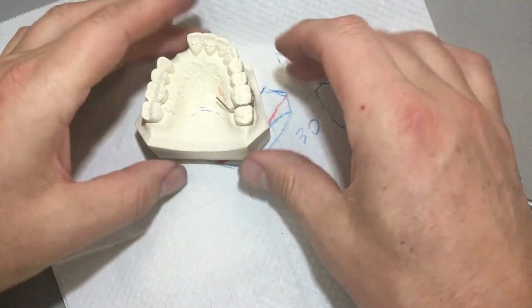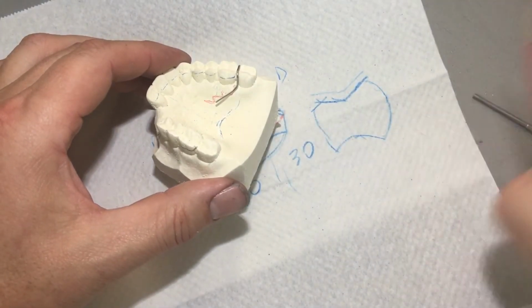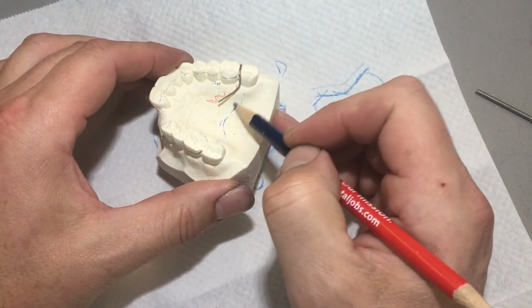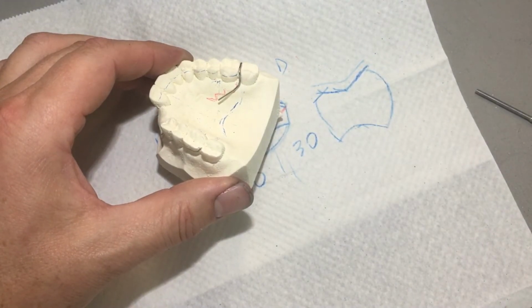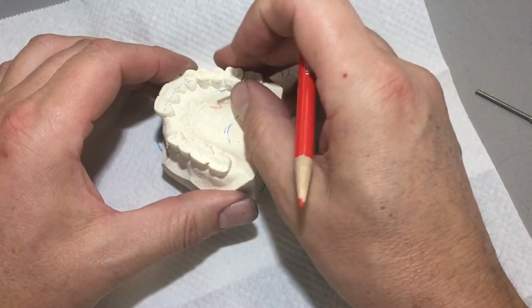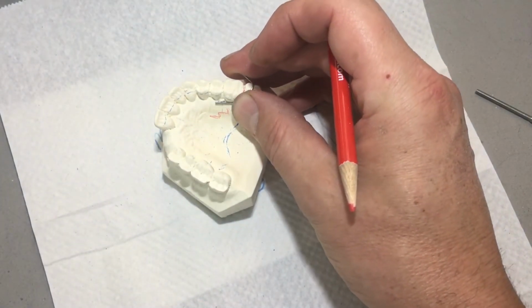Now, if I look from this angle, the wire should be maybe halfway between the lingual gingival margin and the bead line. If I'm too close to the bead line, then the posterior border of the denture will be too thick. If I'm too close to the teeth here, I may tuck my wire under the height of contour, and then it won't fit coming on and off the model.